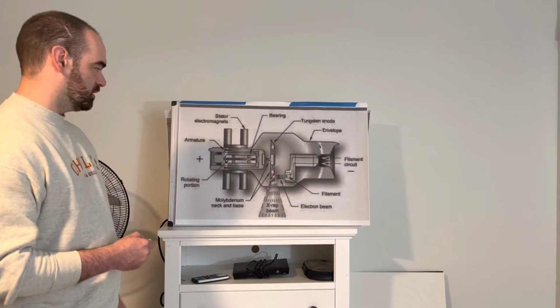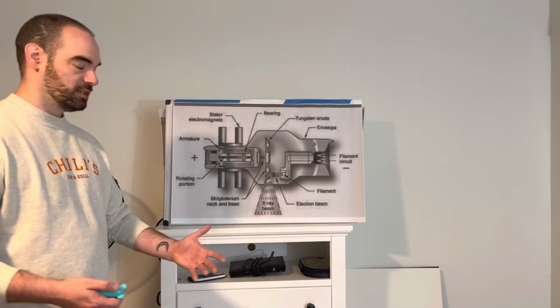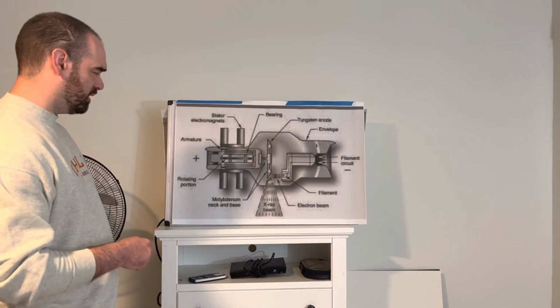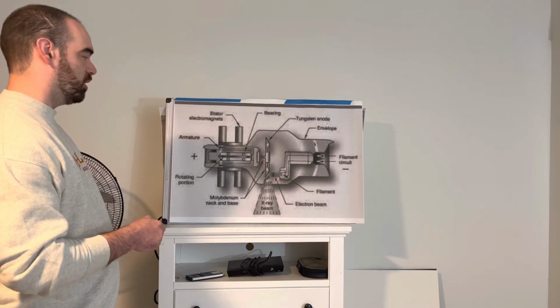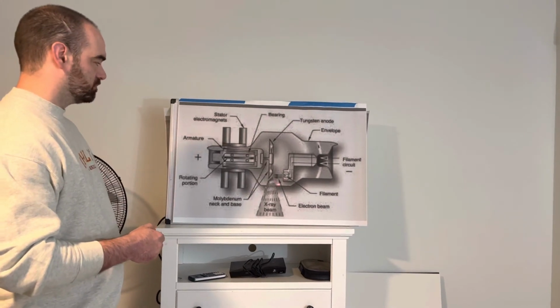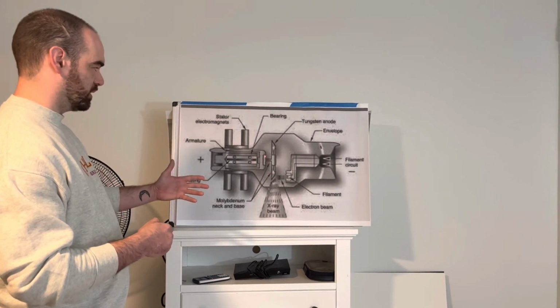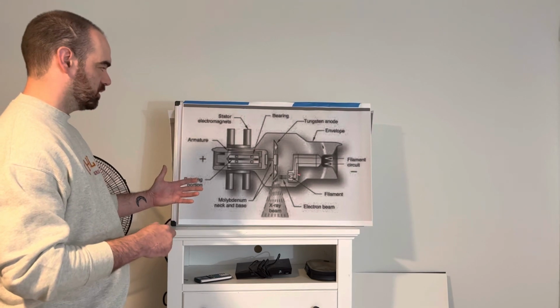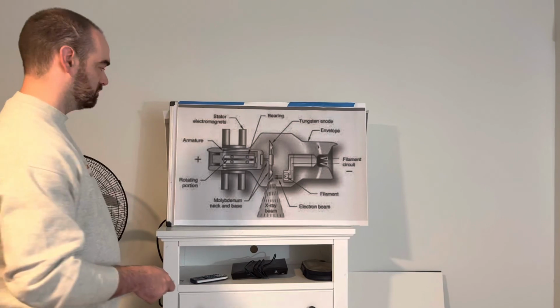At the target anode, that's where the electrons basically turn into photons, which is essentially the X-ray beam. And when it becomes the X-ray beam, not all the photons get shot through the tube. As this happens, some of them get dispersed throughout the glass envelope. All of this is encased in a glass envelope, which is essentially the vacuum, which is necessary for the X-ray tube.